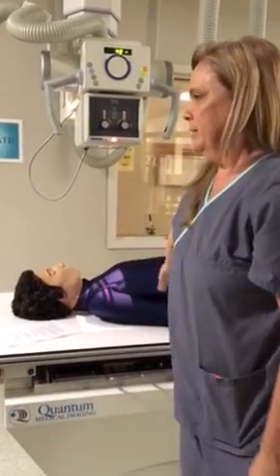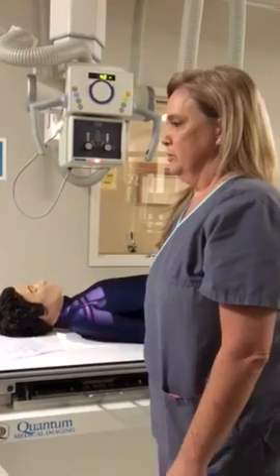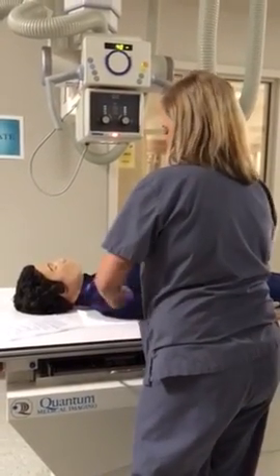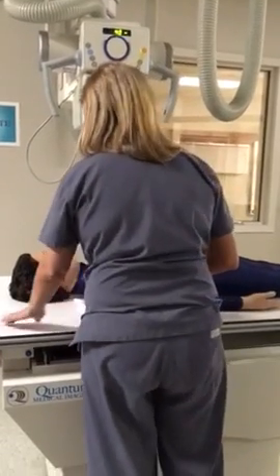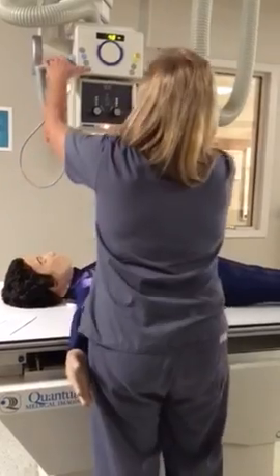All you're gonna do is what? External, right? External, neutral, internal. Please make sure you change your image receptor out after each one, please. Okay. Inferior, superior, we're gonna jump around.